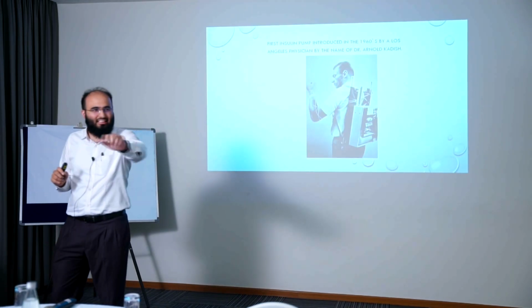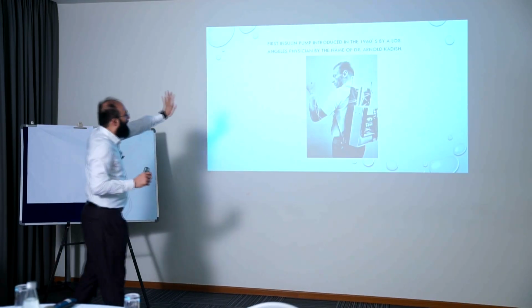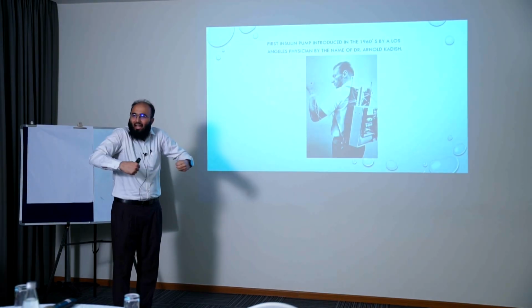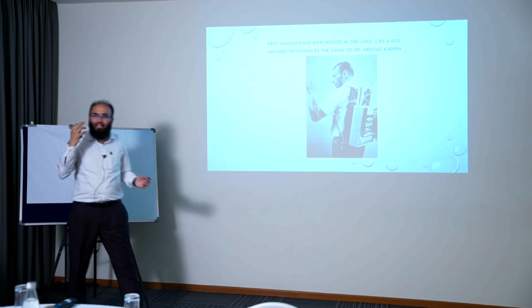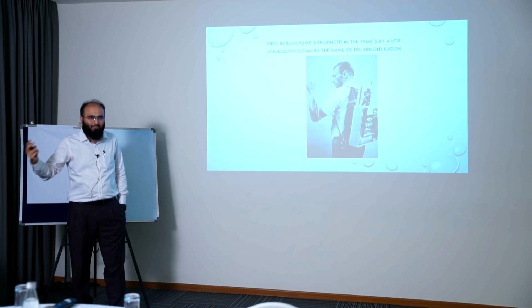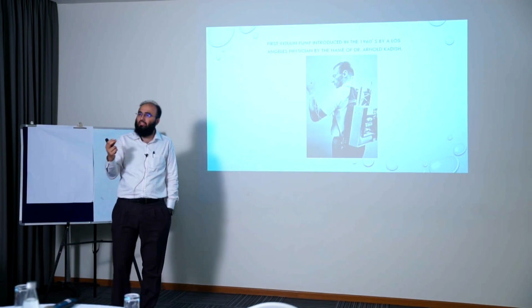Today's pump is the one that is there on your table. And when it was first invented, it was like this. So you had a backpack of a pump, just say insulin would get delivered. So just try to understand the improvement in the model that has happened over time, over decades. And not just the size has improved, but also the precision and accuracy of the pumps.